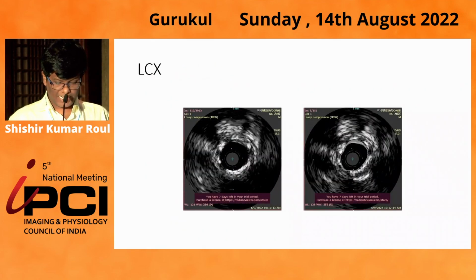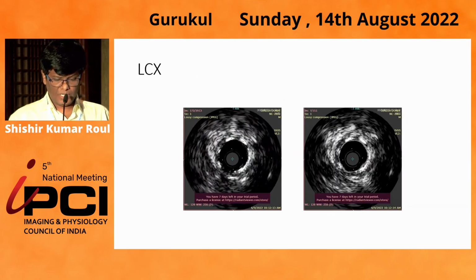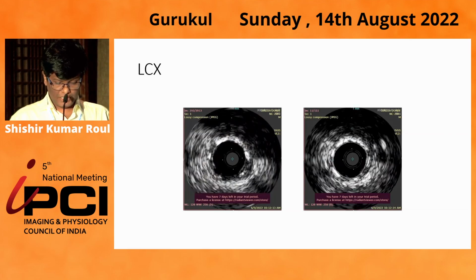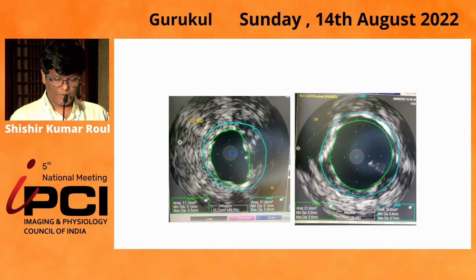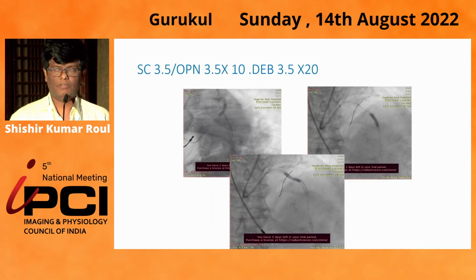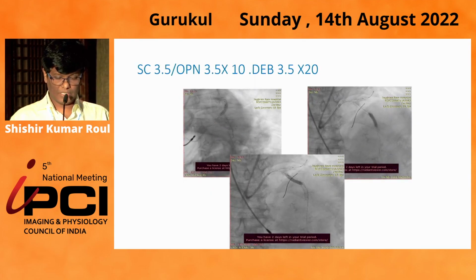You can see that some calcium is coming to the left main. You can see I've done justice to the left main, but the LAD is critically ISR. At the same time, you can see the junk of the calcium at the left main carina, and you can see the calcium from the junction of the left main circumflex also.